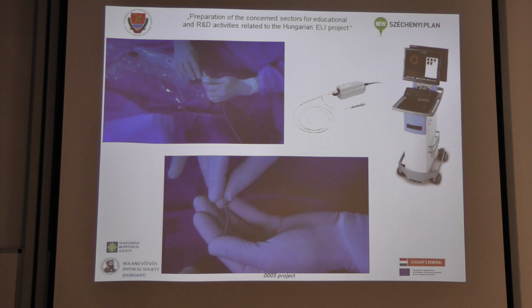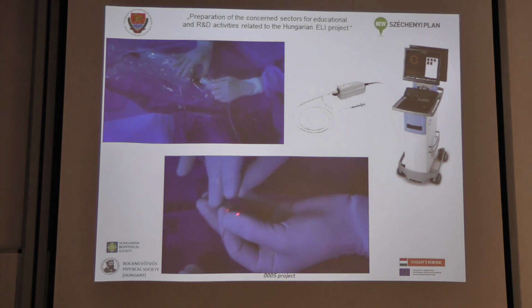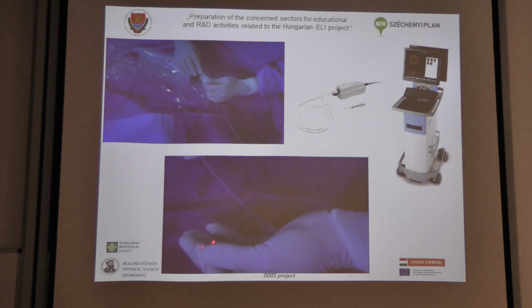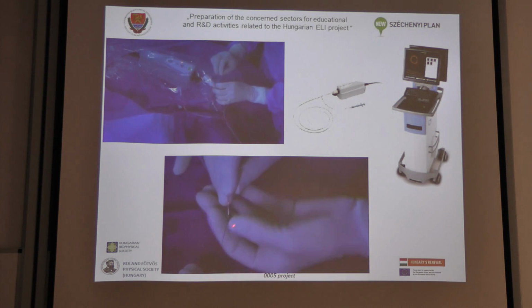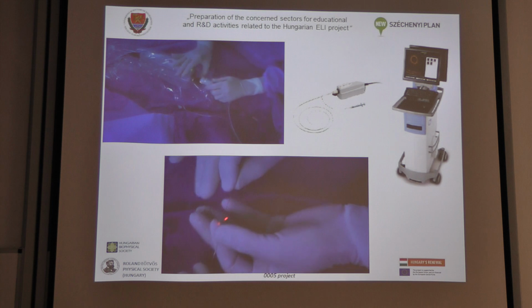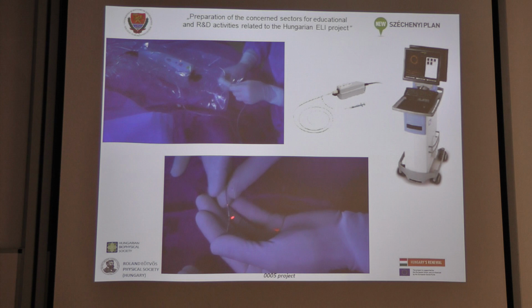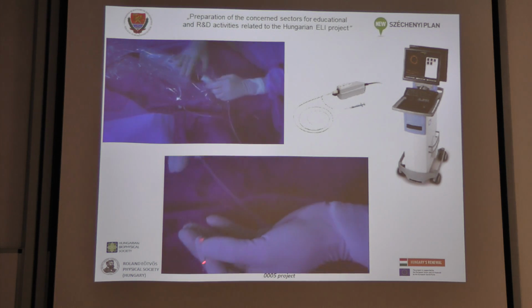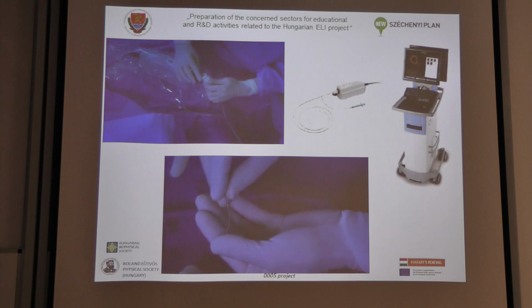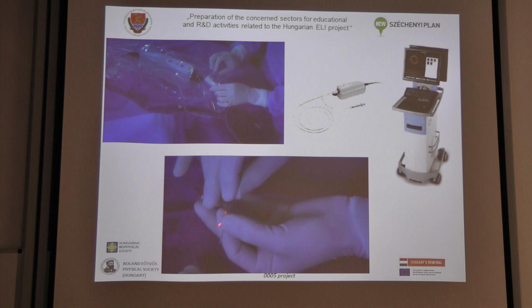So you will see it in the cath lab, but this is a good demonstration video of how we connect the catheter. This is the tiny catheter which goes inside the coronary artery, and this is the distal tip. This is the optical lens, and this is with the new catheter which we've been using in the last year or so. It's only about 2 centimeters away from the very distal tip, so more distally we can track down the optical lens.